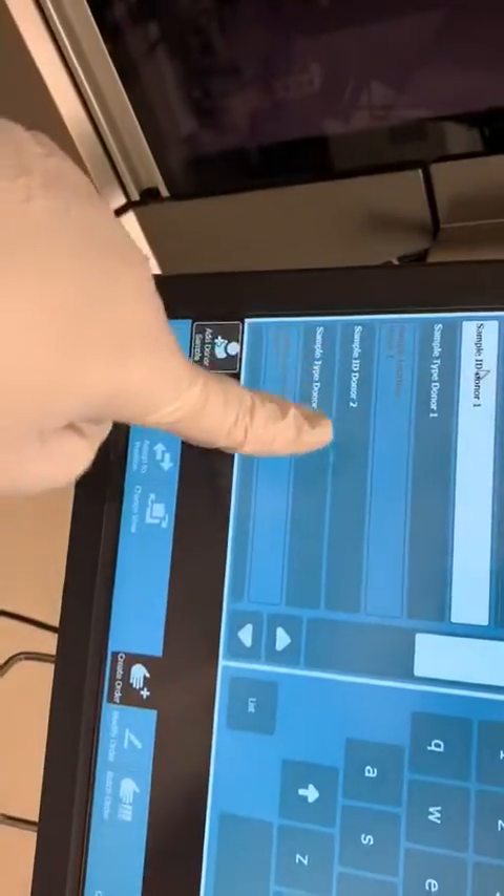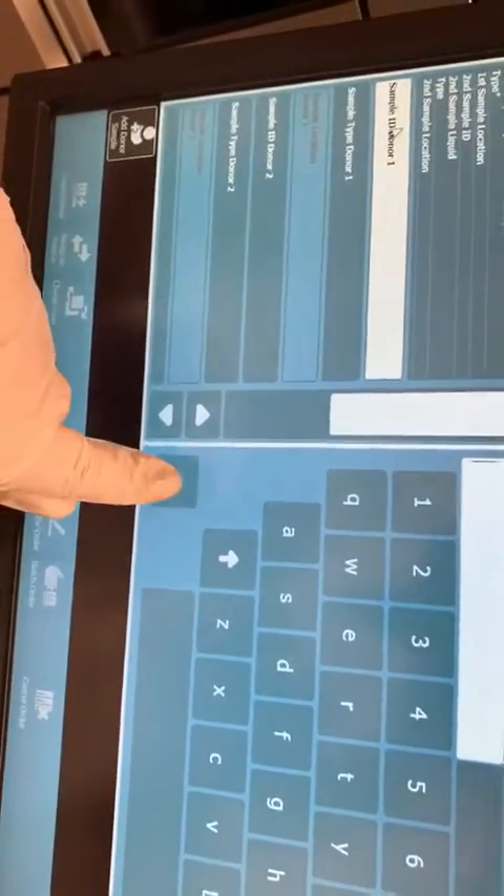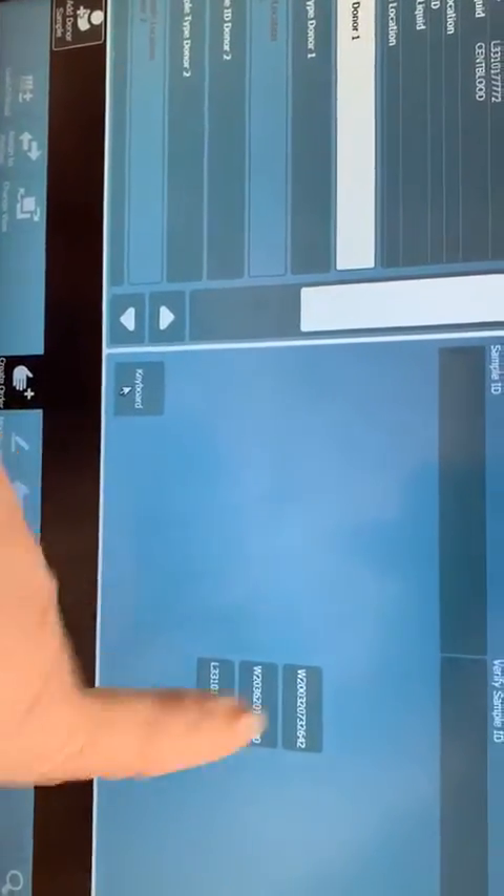I'm going to click up here so I can give the donor number of the first. I don't remember the W number I loaded, so I'm going to hit List and it's going to give me the options of what's on board. The W numbers are my units; the L number is my sample.